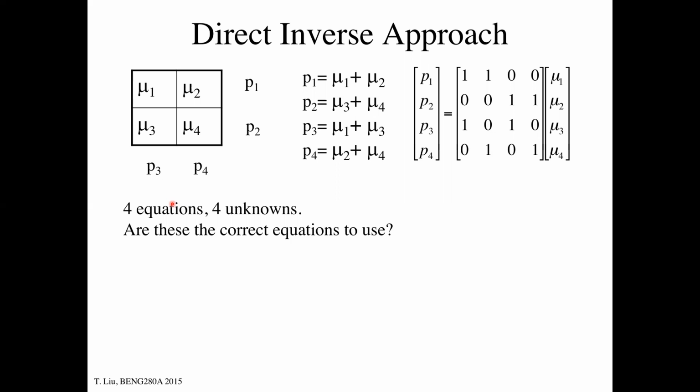When you come in to any X-ray suite, you will see that's the first image that occurred that day. It occurred at 6 in the morning when the tech got there. They just put the phantom in, scan it. It's all done automatically.